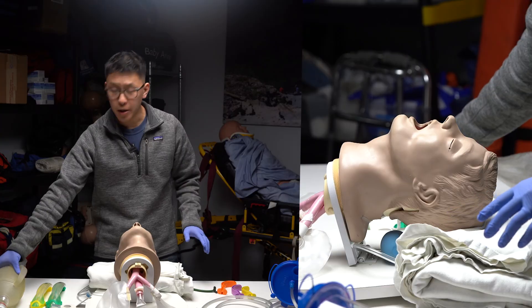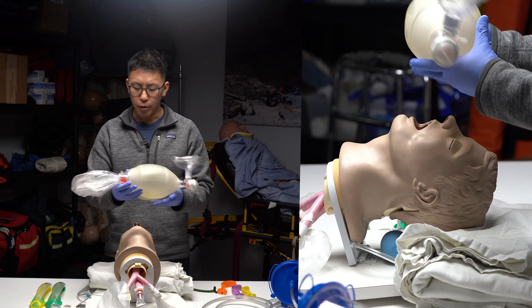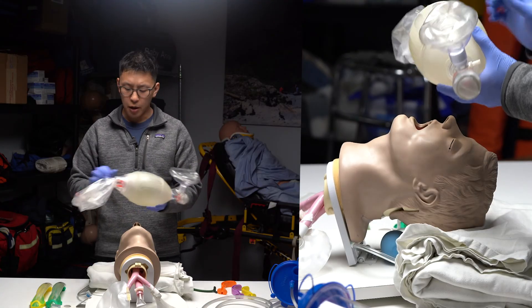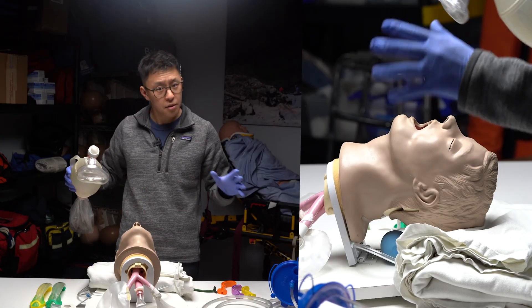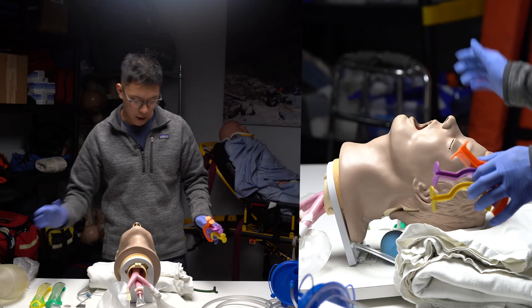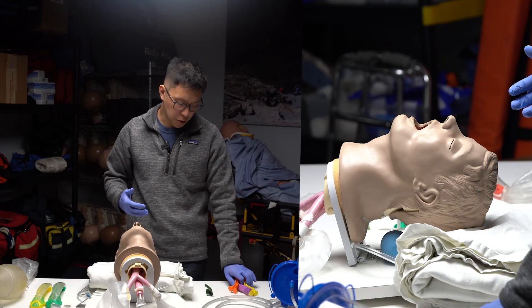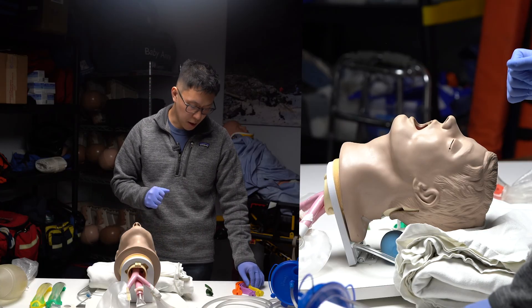Anytime the patient's not breathing, we need the BVM — bag valve mask device — to help them breathe. Hook the notch up to oxygen at 15 liters per minute and the reservoir bag will fill up. Now that we're EMTs, anytime we use the BVM we're probably going to use an airway adjunct — an OPA or an NPA. In this case, the OPA is always going to be our primary. If the patient was slipping in and out of consciousness, that's when you'd use the NPA.